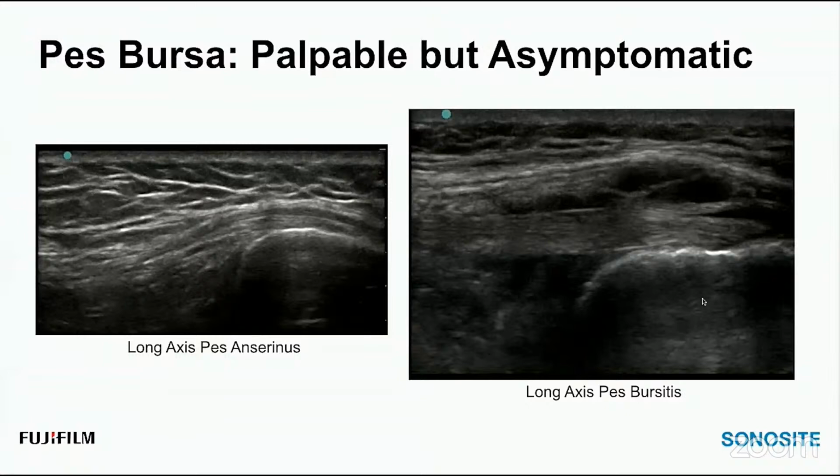if it was free fluid. Another hint that it's free fluid is all of this posterior acoustic enhancement on the femur, on the tibia. And that's because we know this up here is a simple fluid collection. If it were more solid and dense, we wouldn't see any amplification of the echoes underneath the fluid mass. It would just stay just as dark as some of these other blended tissues here. So one other hint that it can be aspirated is you can see the amplification or the brightening of the echoes underneath the fluid collection right over the underlying tendon.